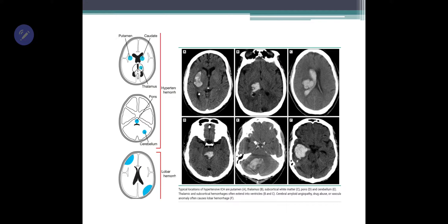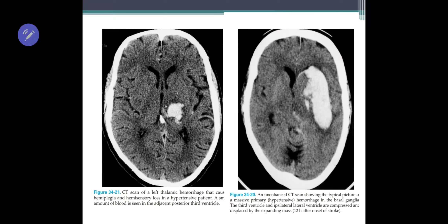This hyper-density is an intra-parenchymal bleed. You can see many more bleeds: this is a bleed in the right putamen area, this is a right thalamic bleed, this is a basal ganglia bleed accompanying many structures, this is a pontine bleed, a cerebellar bleed on the right side, a right temporal bleed, and a thalamic bleed on the left side.